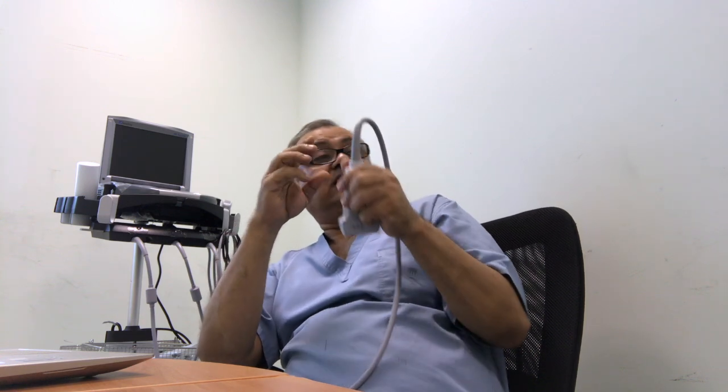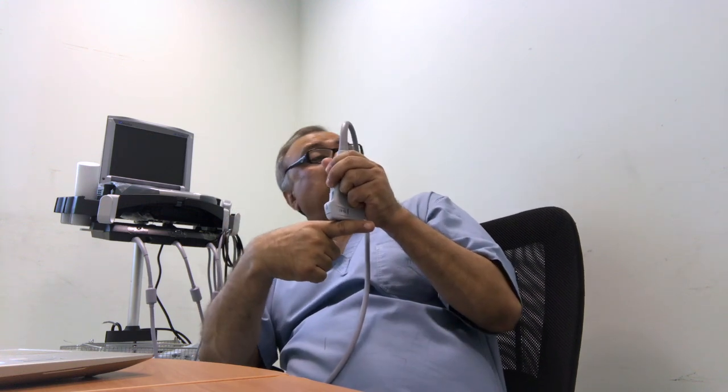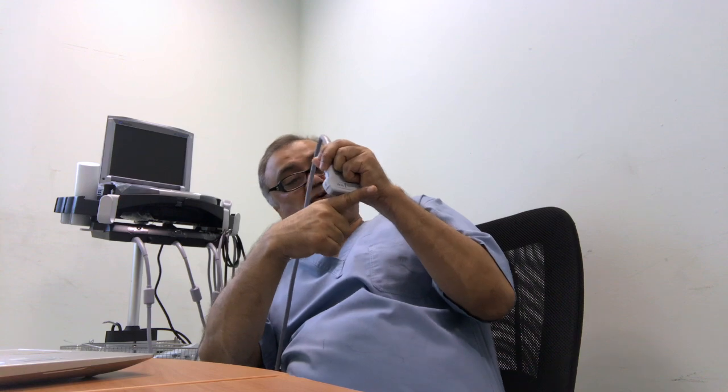So it's easy. The third point of benefit is you are lateral to the artery. You are coming like that, so your probe is coming like this. So there are fewer chances. If you come 90 degrees to the artery, there are chances you may penetrate the artery.